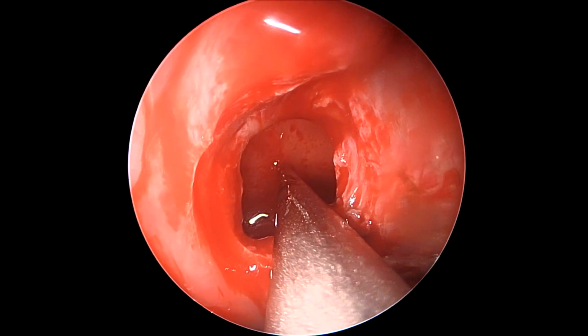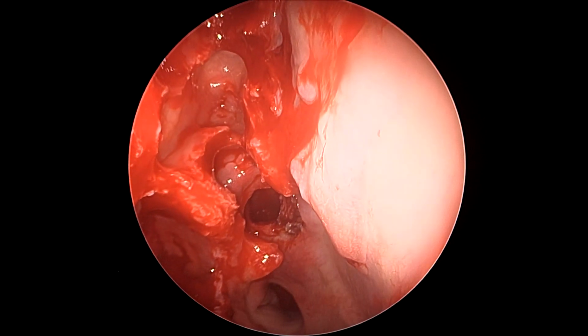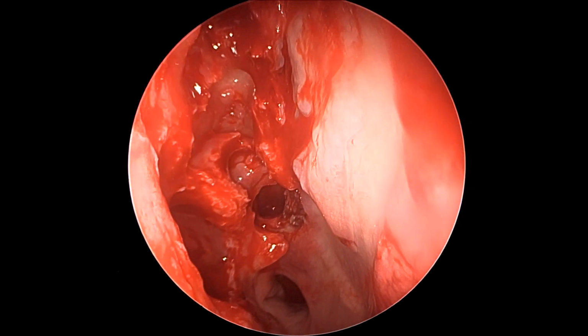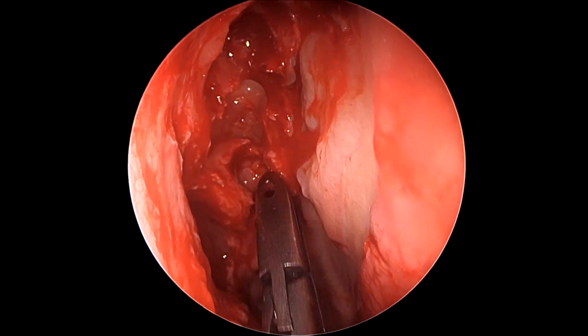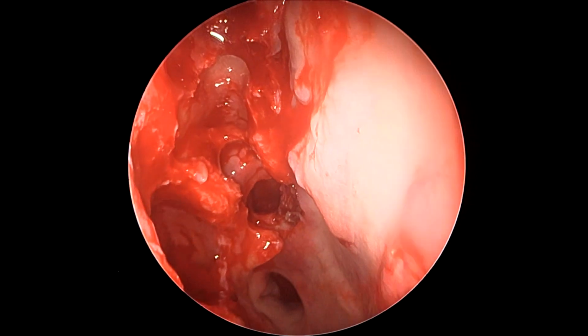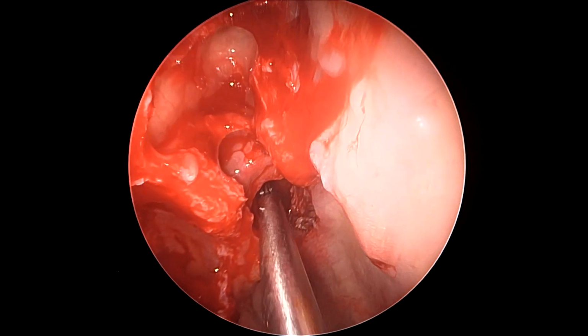Now again, it's very important to retain perspective, as the sphenoid is the lowest of all sinuses and how it corresponds to the medial orbital floor or the horizontal antrostomy ridge. And once it is located, it can be appropriately widened depending on the pathology. Since we do not find any excessive polyps here, you might not need to enlarge it excessively. However, in the presence of fungal disease inside the sphenoid, one might need to enlarge it even more.